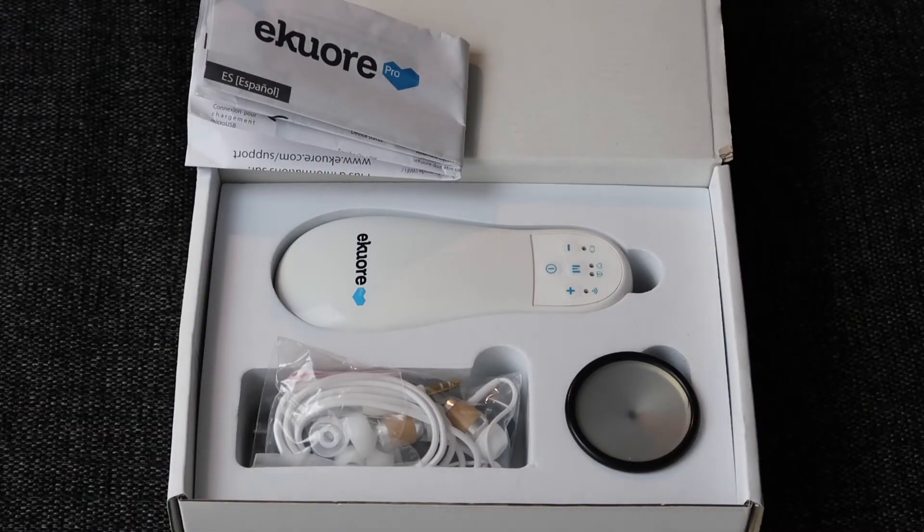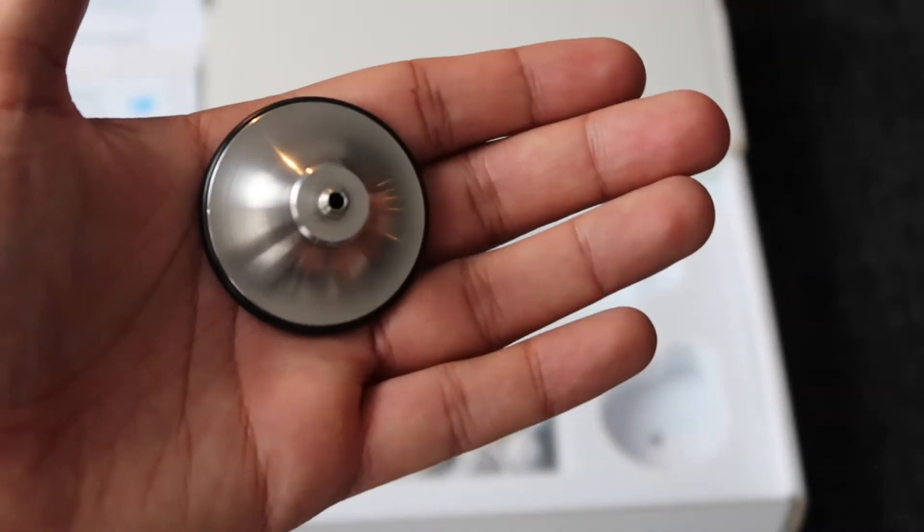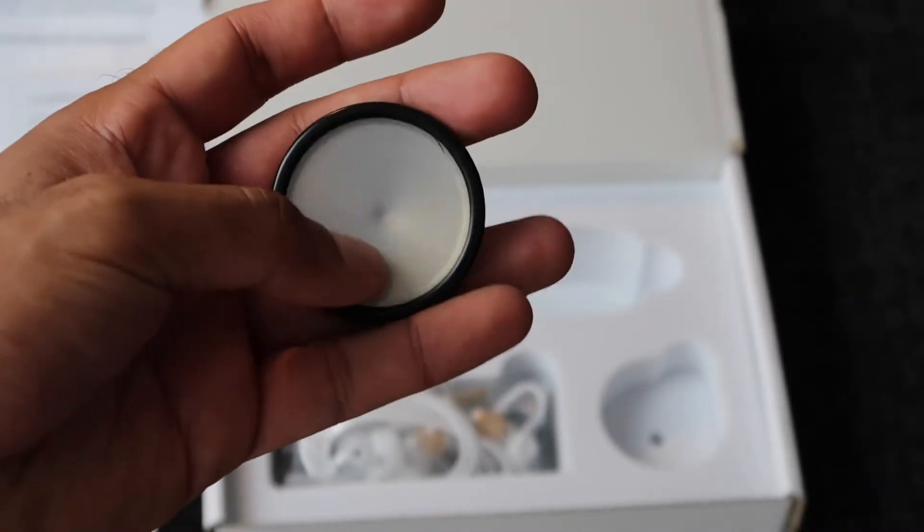Step one is trying to open the box. I feel like this video should be called 'Dr tries to open box.' And this is what it looks like inside the box — we've got what looks like the head of a stethoscope. This actually looks like the head of any old stethoscope, but it's got a small screw cap at the end of it which presumably will screw onto the device itself.